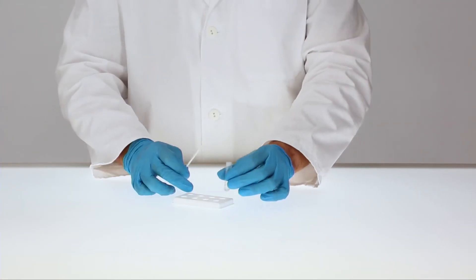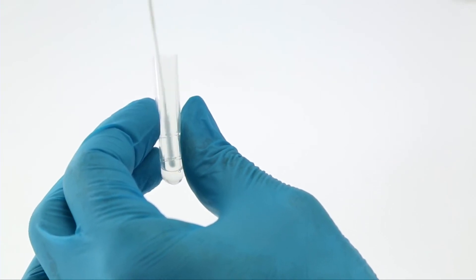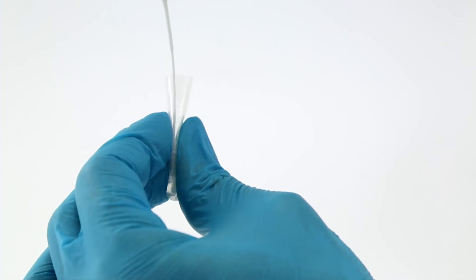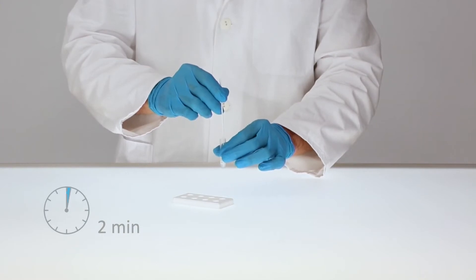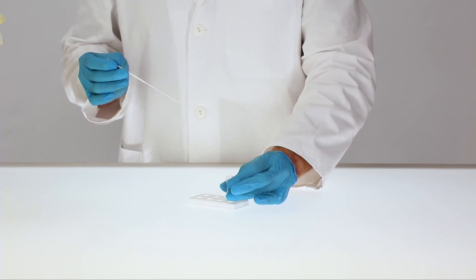Insert the swab with the collected specimen into the tube. Swirl the swab and squeeze it by compressing the swab and extraction tube 10 to 15 times. Then let the solution stand for two minutes. When removing the swab, squeeze out as much liquid as possible.